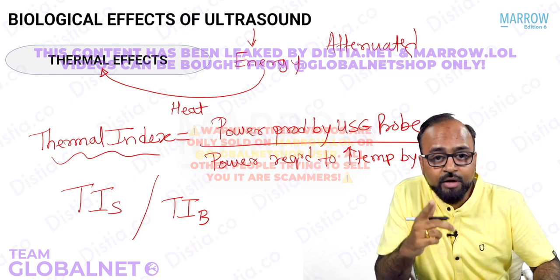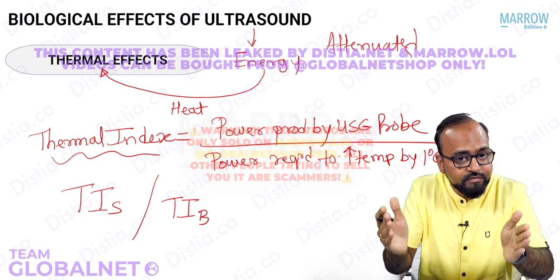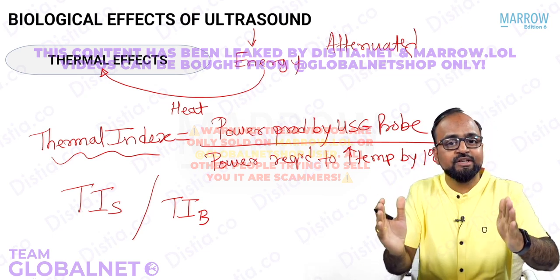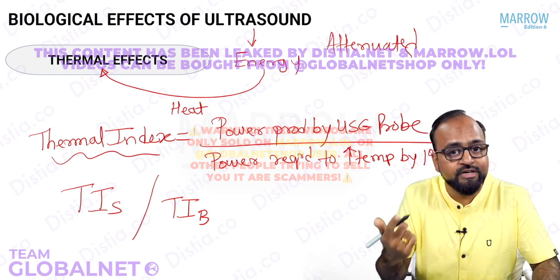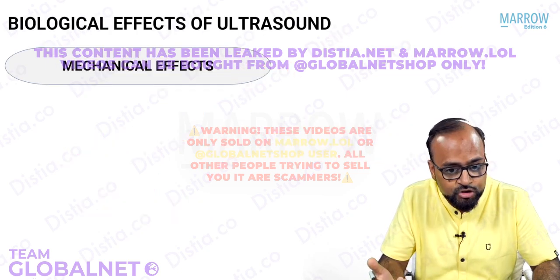But do you remember I told you ultrasound is what? Ultrasound is a mechanical wave: compression, rarefaction, compression, rarefaction. This increased pressure in compression and decreased pressure in rarefaction can also create certain effects on the body. These are called mechanical effects or mechanical damage.